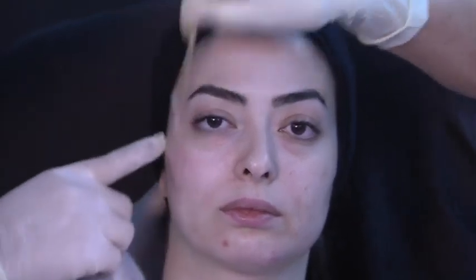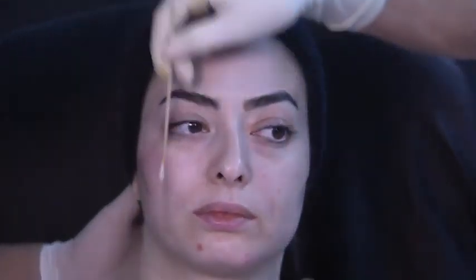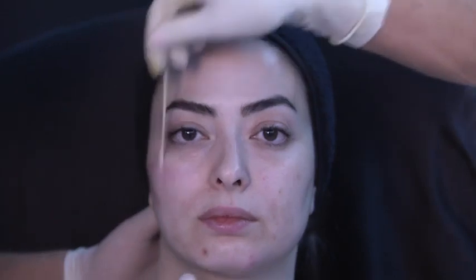Okay, perfect. So from the zygoma, going all lateral, you can see the entry points with a little bleed here of my 4 points, going all along the zygomatic arch, more lateral than usual, because what I want to create is this image. Can you sit up? Okay, look at this. We are making her look thinner, and we have now a shape, and we are creating a very nice, elegant cheekbone for a young lady. This is a square face. Look at this face, it's completely square.